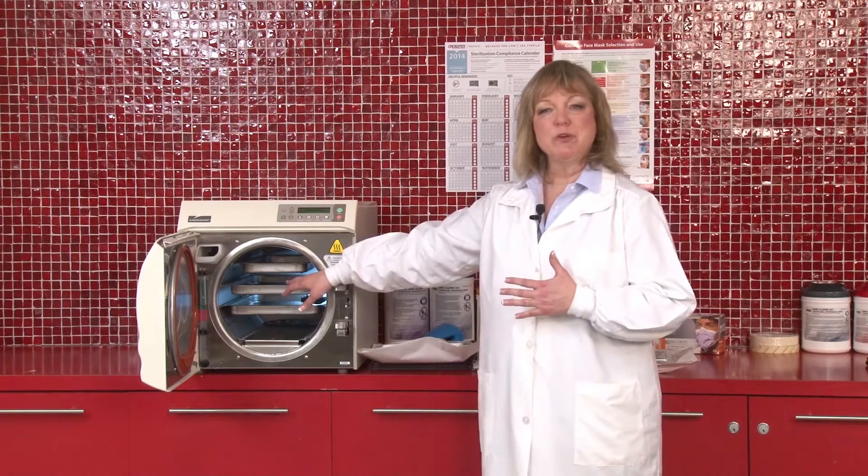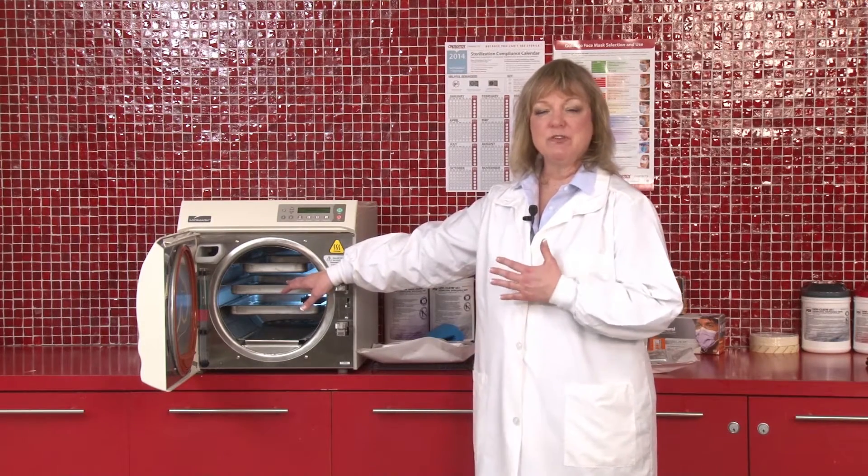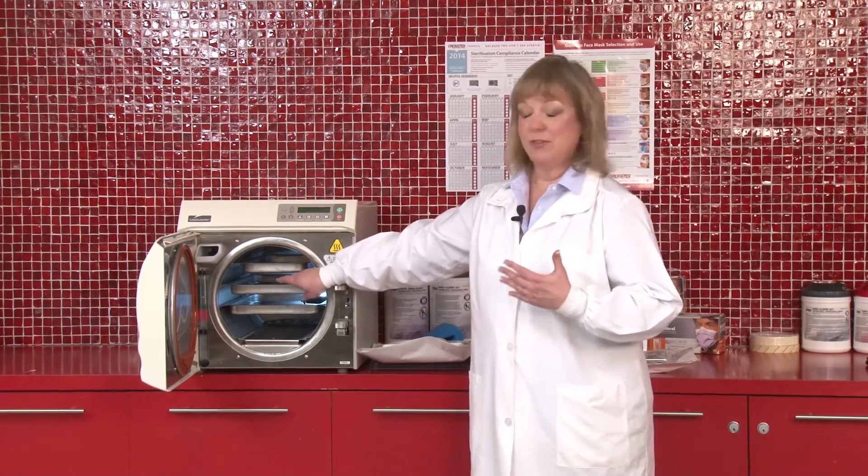In your sterilizer, you always want to make sure that you're using your original equipment as far as the accessory pieces such as the trays and the racks.